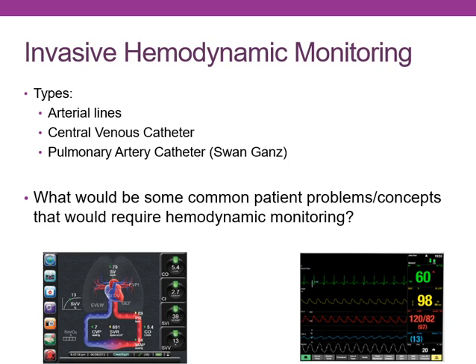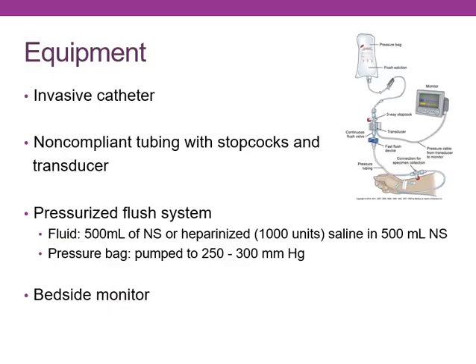I put a couple of little JPEGs in here for you so that you can see. This is a cardiac monitor, so we've got heart rate and EKG here. I've got O2 sat. This red is an arterial pressure, and then this blue is CVP, and that's pretty standard. This is called a FloTrac. This is getting our hemodynamic values from an arterial line, and then we bring over the CVP, because remember CV, the V is venous, so this is coming from my central line. The rest of this is being calculated off an arterial line. And you can see I've got CO, CI here. Here's my SVR.